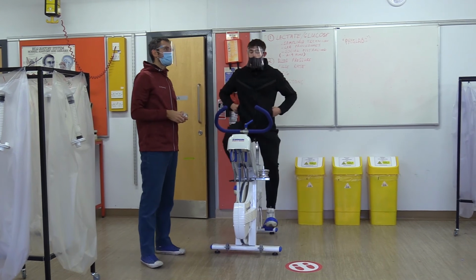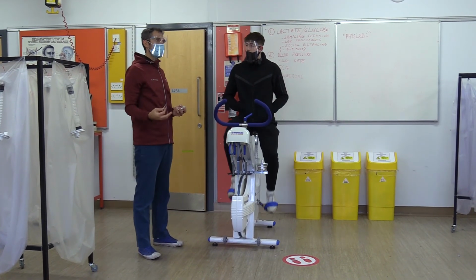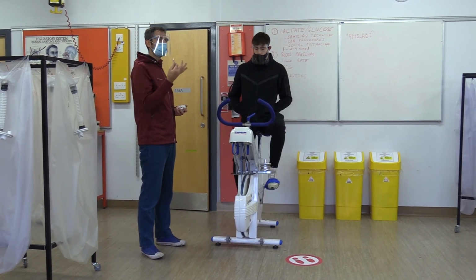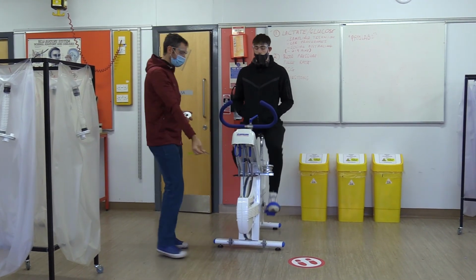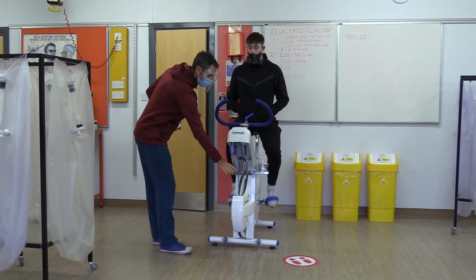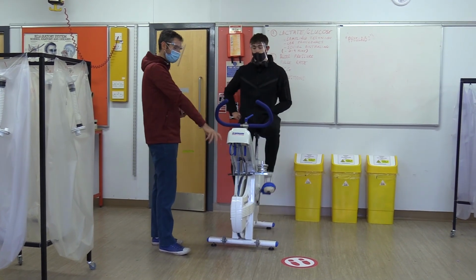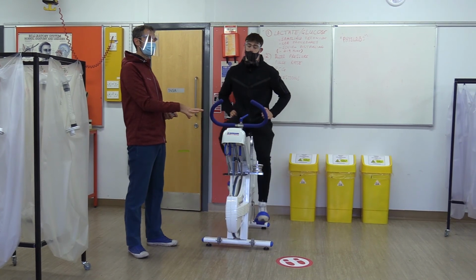When cycling at 60 RPM, every 100 grams you add to the basket will make it 6 watts harder. So increase the wattage by 6. So these ones, the little ones, are 100 grams. So I put that onto the basket, and that will now be 6 more watts harder for Will to cycle. Should mention as well, so with just the basket on, cycling at 60 RPM, that is 60 watts.